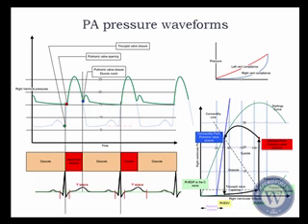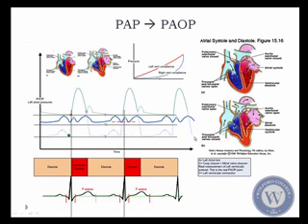In some situations where you have extremely stiff or calcified arteries, you will see that the dicrotic notch will almost not be visible, simply because you won't have any elastic pressure rebounding back. Another reason you would see a loss of the dicrotic notch is low volume states inside the pulmonary circulation, where there's just not enough volume to squeeze on to cause that dicrotic notch to be created. So that's another way of watching if your preload is dropping in certain situations.